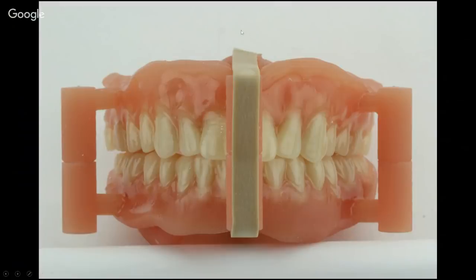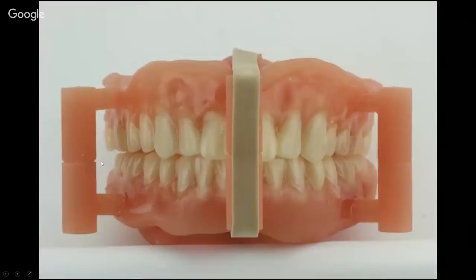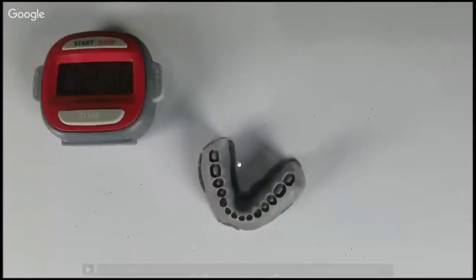So even though I didn't do a true remount on this, if those pins were open as compared to right here where they're fully closed, that would be indicative of some tooth movement that threw the occlusion off. Well, to have no more than just that tiny bit of hairline opening across all of those pins, that's pretty impressive to me. So you can see the lingualized setup here. And then that basically concludes that case.